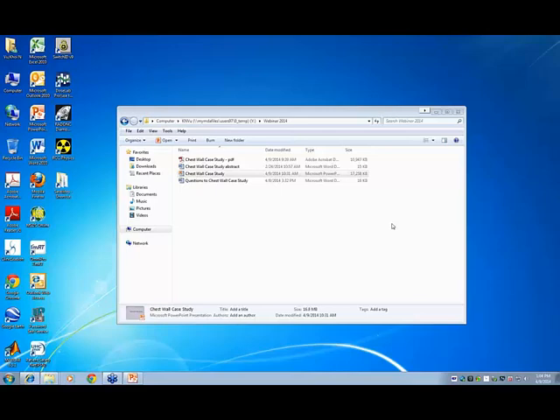Okay, another one is, isn't 45 gray low? We treat the whole chest wall to 50 and boost the patient to 60. Yeah, for that patient, I asked the physician, and it's more of a PAL case than a regular chest wall case, and so that's why she decided to go with the 45 gray instead of the traditional 50 gray.